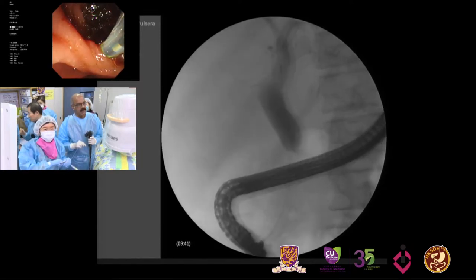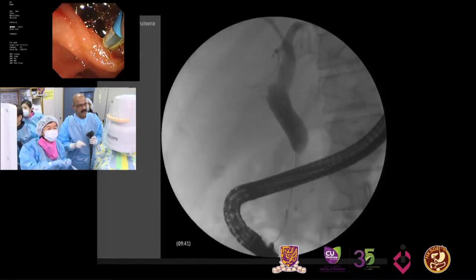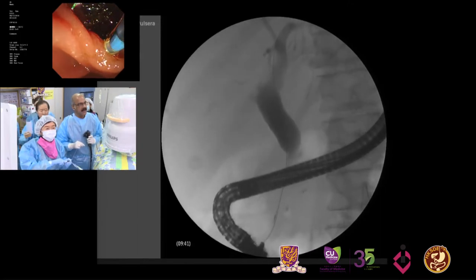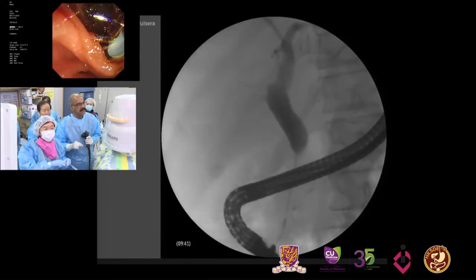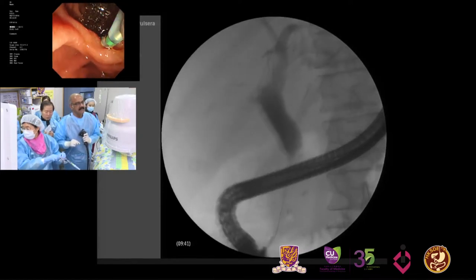Push the wire, I'm going to pull back. So language is very important. I ask her to push and I'm pulling back, okay? Now I'm coming, I'm going to see where the sphincterotome is. You can see the sphincterotome has just come out here, just at the papillary region.